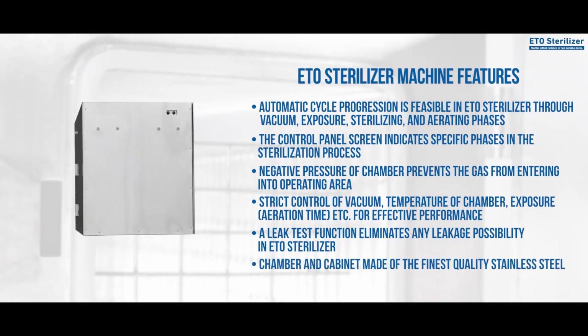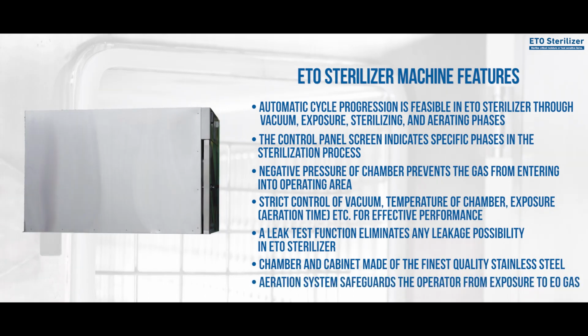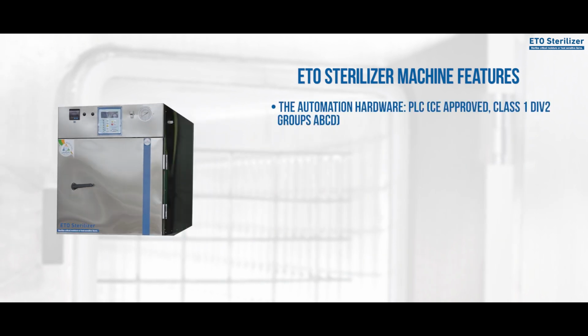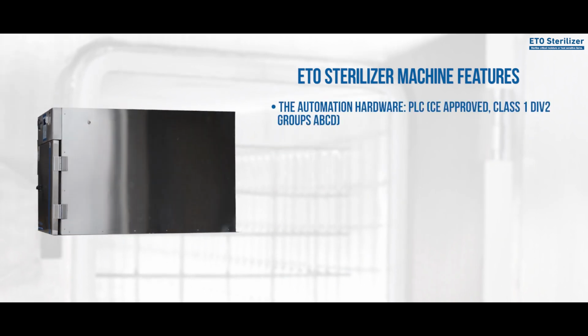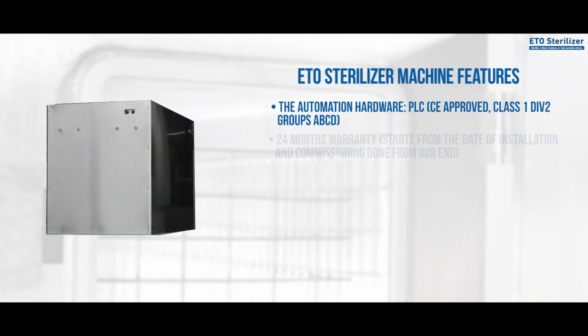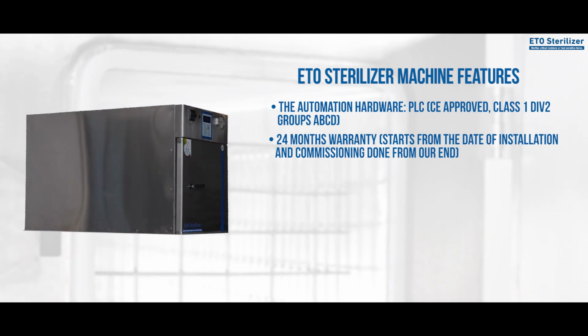Chamber and cabinet made of the finest quality stainless steel. Aeration system safeguards the operator from exposure to EO gas. The automation hardware, PLC, CE approved, Class 1 DIV 2 Groups ABCD, 24 months warranty. Warranty starts from the date of installation and commissioning done from our end.